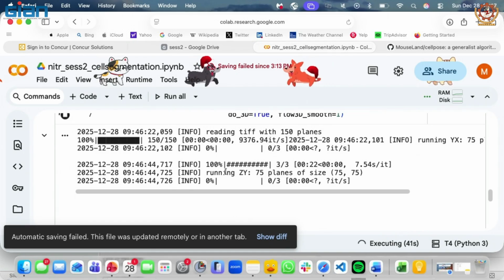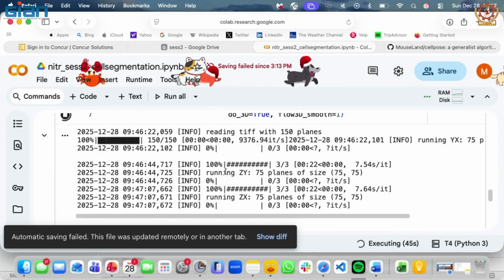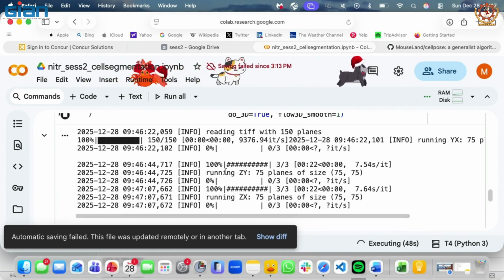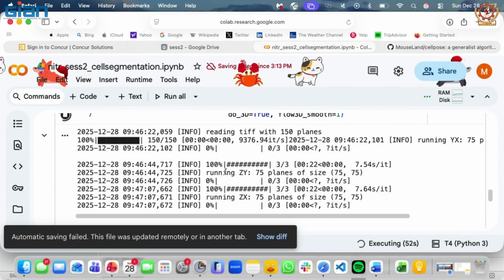The question can be, I had this question when I was first trying to do cell segmentation: what's the application? Of course, Dr. Prasanna discussed a lot of applications after cell segmentation. You can create all those graphs and extract features. What else? Okay, let me simplify the question.